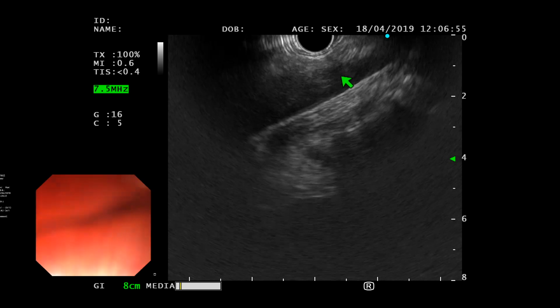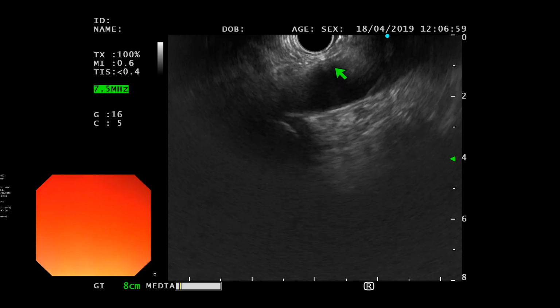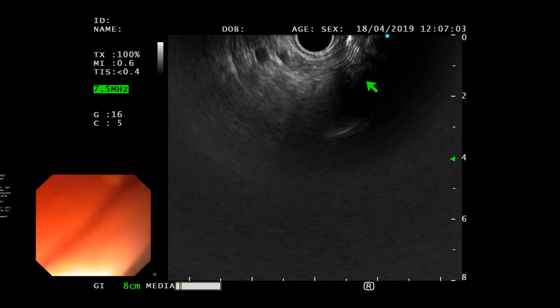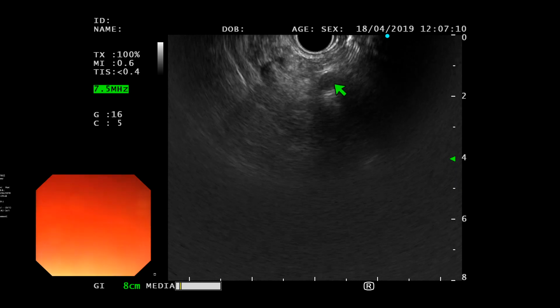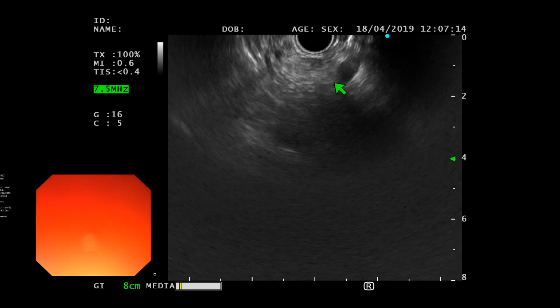Okay, advance. Celiac. Relax your big wheel. Spin it a little left and right with your wrist, the other way. There's your celiac, right? So relax your wheel as you advance forward. Advance a tiny bit. And now go clockwise.